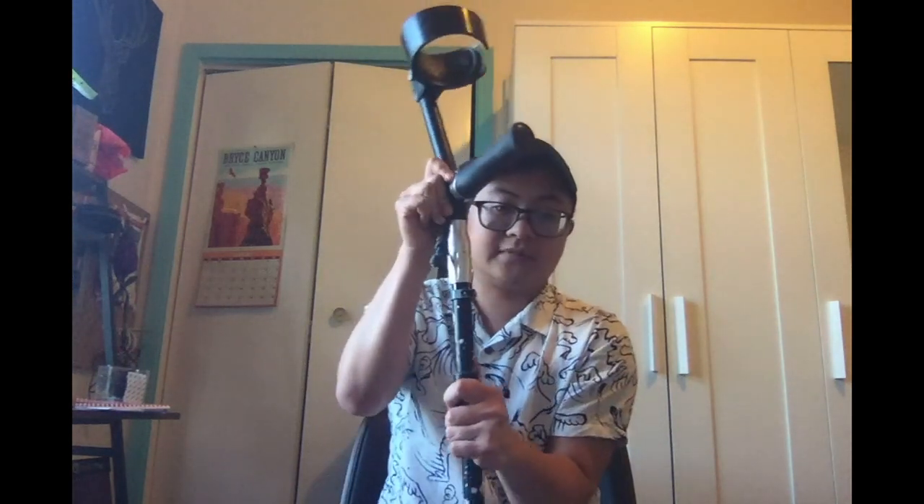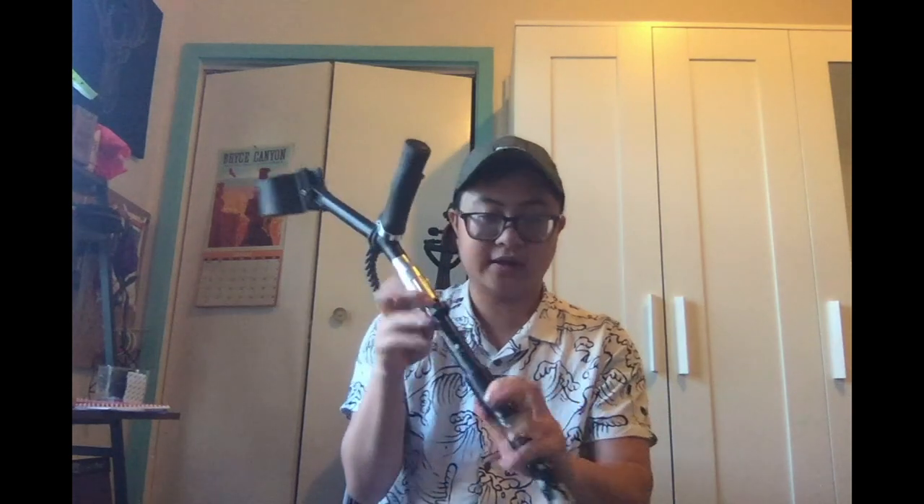The best part of these Side 6 crutches is the shock absorber — it's an elastomer shock absorber. It is really reliable. It doesn't have that pogo effect that cheaper crutches with shock absorbers have. It works reliably, and it really helps to dissipate the wrist pain and shoulder pain that a lot of long-term crutch users experience.